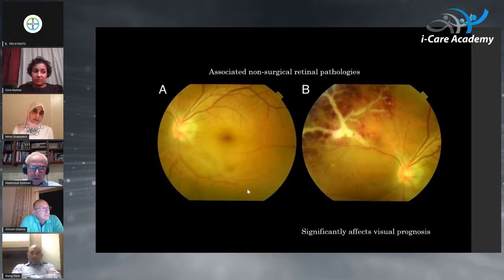I do a phaco, implant the lens, and then I do a pars plana vitrectomy, clear the vitreous completely. If there are epiretinal membranes, I remove epiretinal membranes. Again, a frequent finding in these patients, epiretinal membranes. And then sometimes during the vitrectomy, I use triamcinolone, which is again an asset to relieve some of the inflammation in the eye. And I have found that this is an approach which gives me much better results than the approach I used to do years ago, doing the phaco and then just injecting triamcinolone at the end of the surgery. Many of those patients, I had to go again later on and do a vitrectomy.